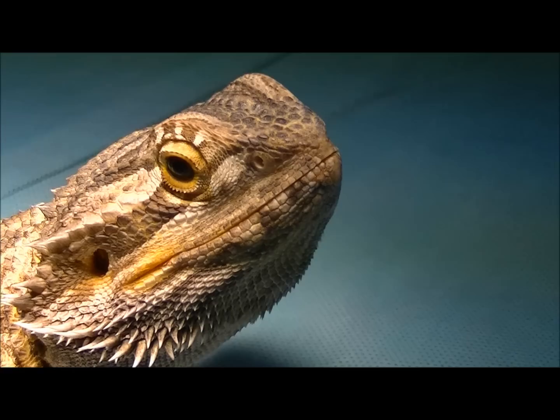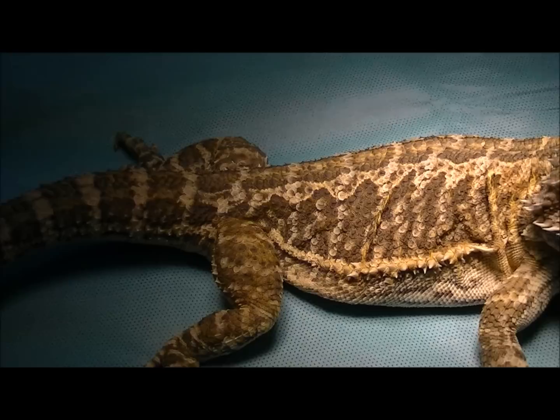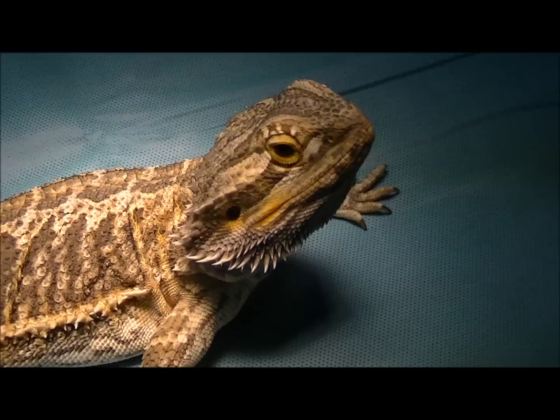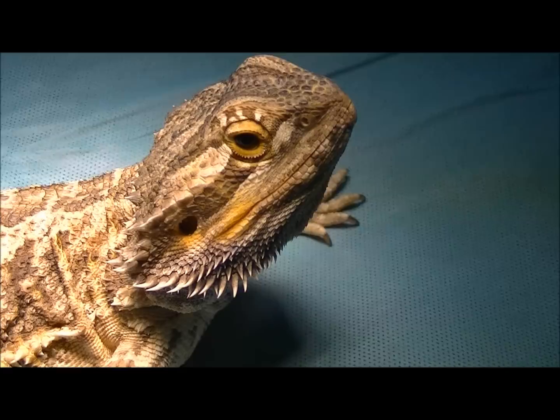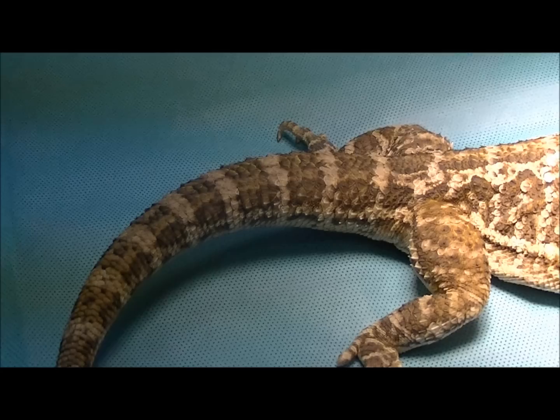Hi everyone, Shane from The Reptile Doctor, and this video is going to be of desexing a dragon. This is Icy, a very nice looking female central bearded dragon sitting on the surgery table. She's had some problems with cloacal prolapses, and her owners have decided they don't want to risk her breeding, so they've elected to desex or spay her. We're going to video that today to show you how we spay a normal healthy dragon. We'll set her up for anaesthesia and then get going.